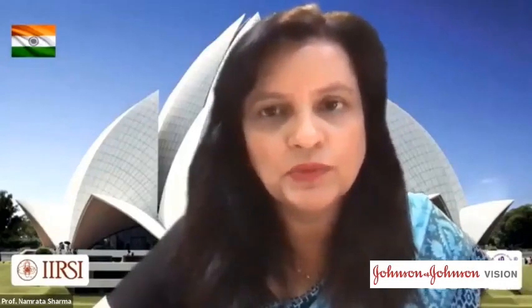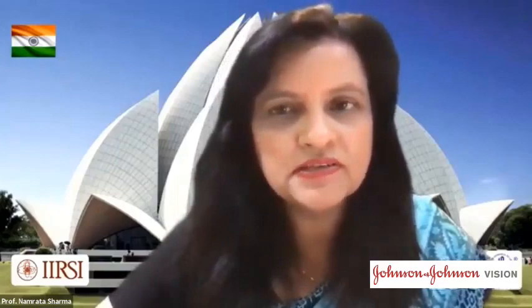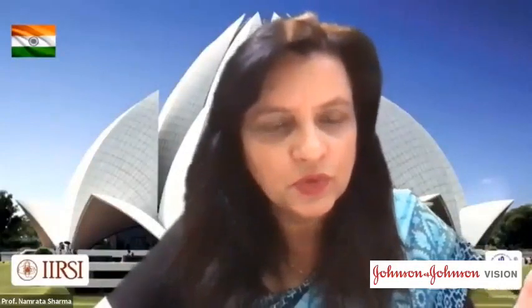This is for Dr. Vasavada, sir. If there's a patient who has an iris coloboma and also has an iridofundal coloboma, then what would you suggest in those cases? Actually, until Amar taught me this, I used to do segmental implantation in the bag for these colobomas, which will cover the area and works very well. Now, would anybody want to differ from this? You would still go ahead doing a pupilloplasty for these cases? Yeah, we are doing pupilloplasty. Even with a fundal coloboma? Even with the fundus coloboma, because we close that iris defect a little bit, which helps the patients a lot.